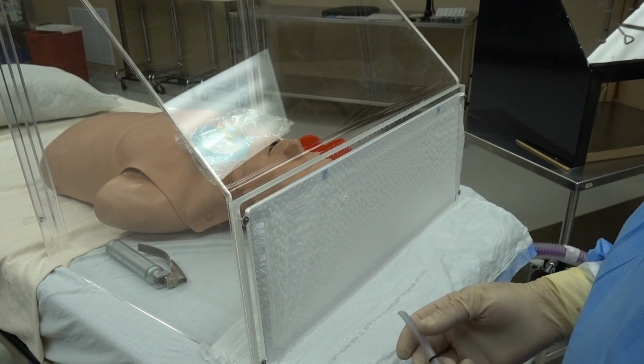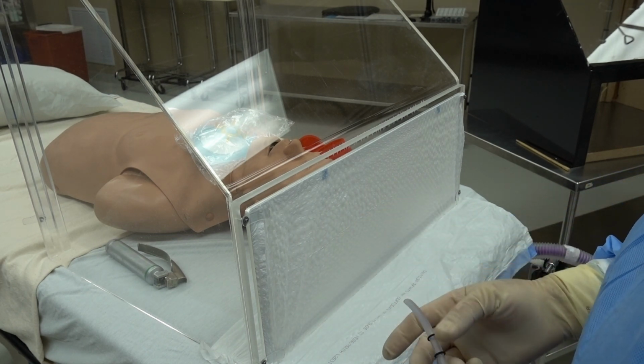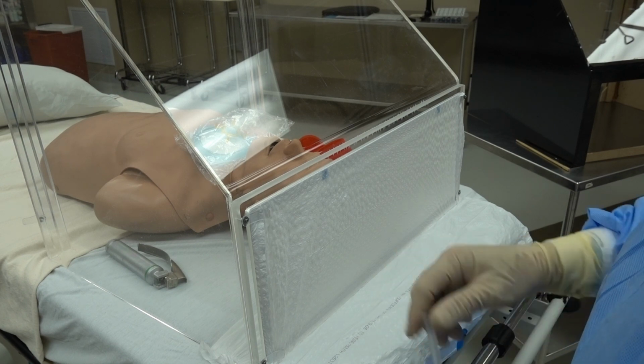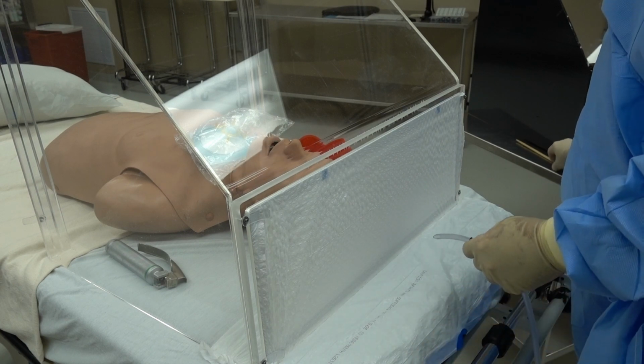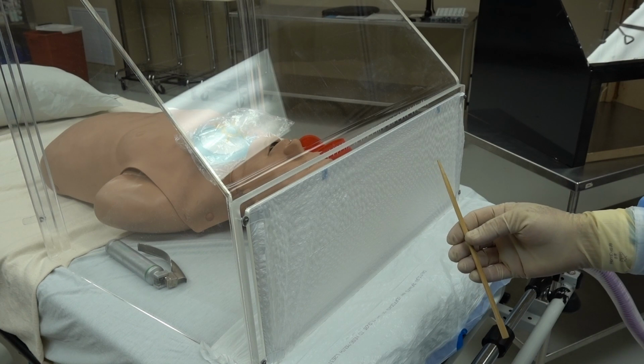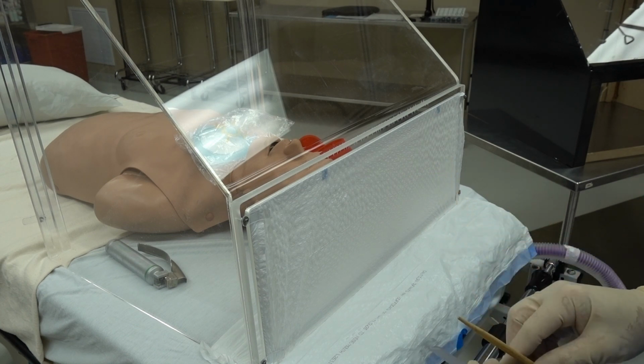I don't have one of those handy, and believe it or not, they couldn't find me one, even though we do corneals and dissections here. At night, people don't know where things are. So we're going to use something else. Any sharp instrument, you literally use your pen to make one, but you want it smaller than what you're putting through there so it seals.